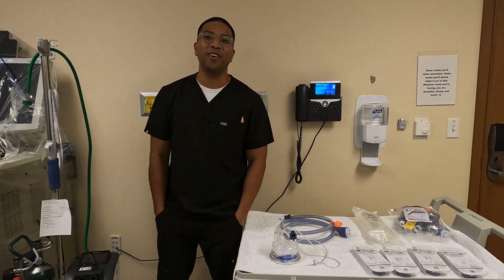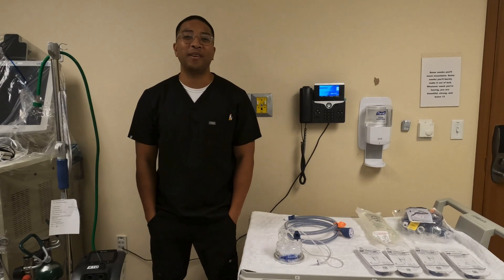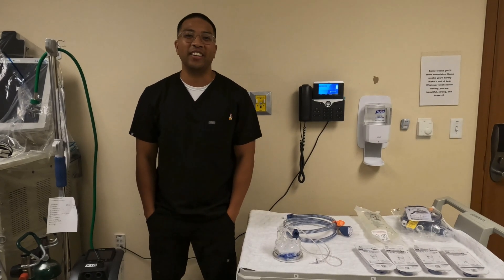Hey everyone, my name is Brian. I'm an RT here and today I'm going to show you how to set up, use, and assemble the Airvo3 High Flow Nasal Cannula.